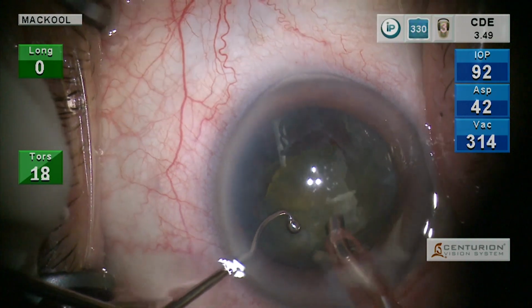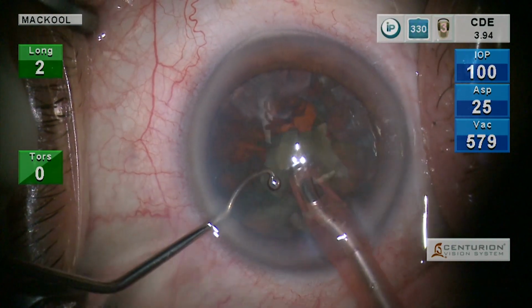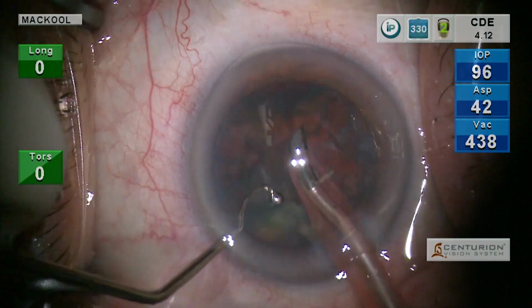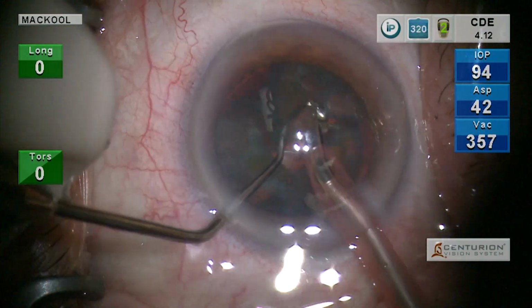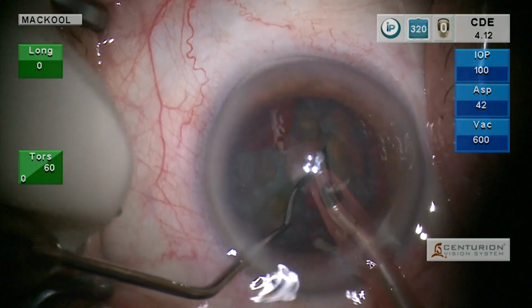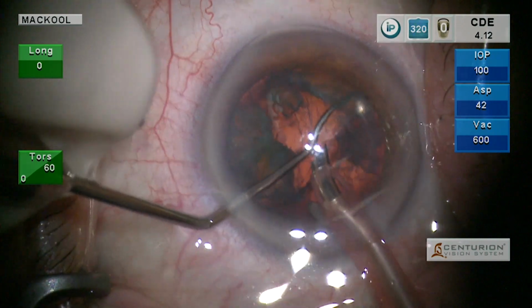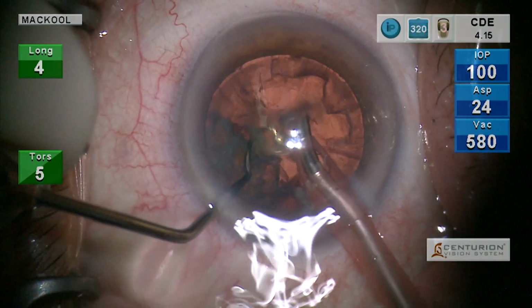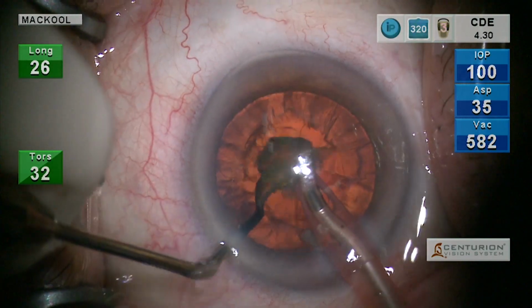So it's a moderately dense nucleus. And the rhythm of the phaco position 3 utilization is so important. The more experience the phaco surgeon has, the less you hear bzzz, and the more you hear bzz, bzz, bzz, bzz, bzz, like that. And that's really how you efficiently use ultrasound.